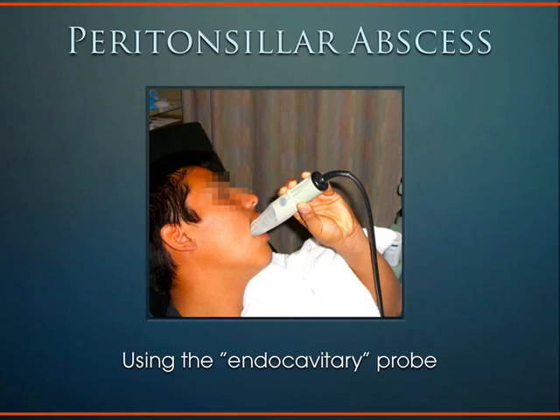So the tonsillar pillars can be seen on ultrasound quite easily. In fact, you can even see lymphadenopathy in the back of the throat as well in somebody who just has a normal, enlarged lymph node reaction to having an infection in their throat. But the problem is you can also have an abscess cavity start to form adjacent to the tonsil, and this can be somewhat difficult to diagnose clinically because the patient may have a lot of redundant tissue in the back of their throat, and it's not as obvious. Sometimes they're very obvious. You see the uvula deviate to one side, uvular deviation.